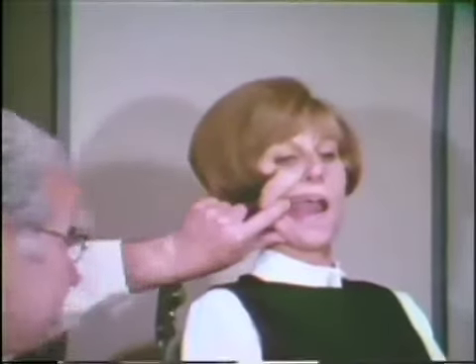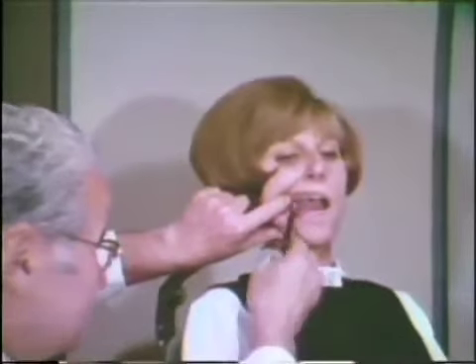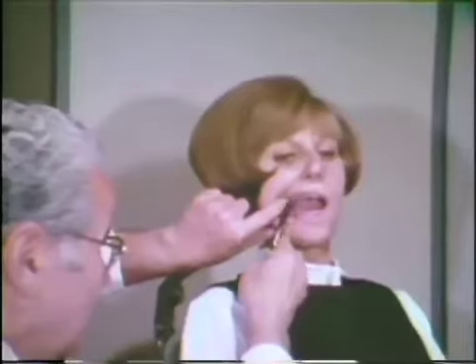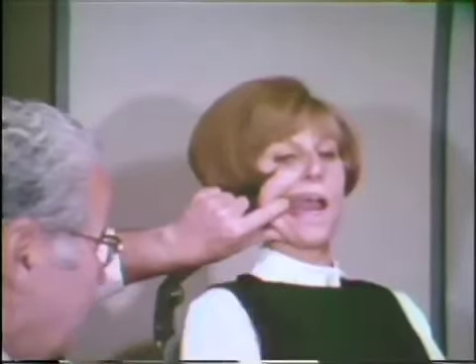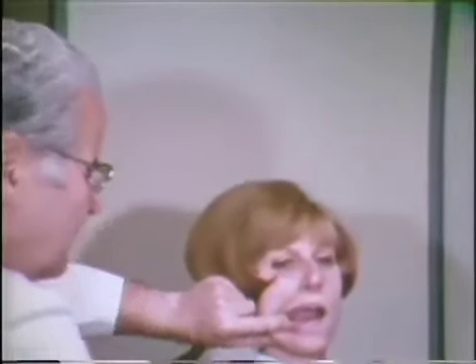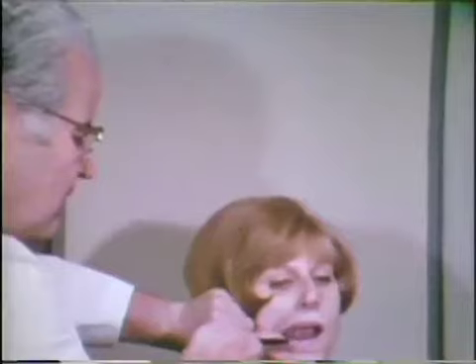If the examiner positions his eye at a location that permits him to see through the interproximal spaces of the posterior teeth, and then directs the X-ray beam in the same direction, no overlapping of proximal surfaces should occur in uncomplicated cases. Both upper and lower segments should be visualized, of course.